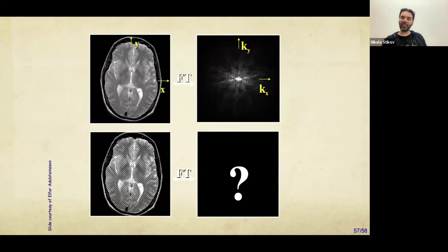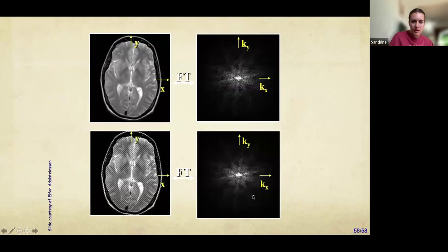So what does the artifact in the Fourier transform space look like? Can you tell me what the Fourier transform will look like if this is the Fourier transform of a normal brain? It can be just like one point. Exactly. It's just a point here. As we were passing through that point with our gradients, somebody opened a door or somebody created some kind of parasitic interference that is giving us a false signal. So in MRI, you see this a lot. And fortunately for this one, you just set that value to 0, and then the image is going to be back to normal. It's not always that simple, but this kind of artifact is very common because every time something happens as an impulse, you will see it as a pattern over your image.